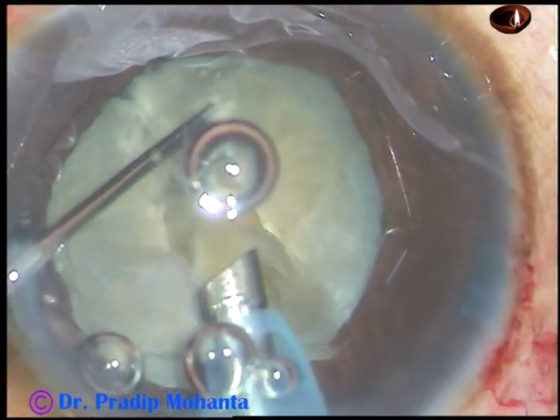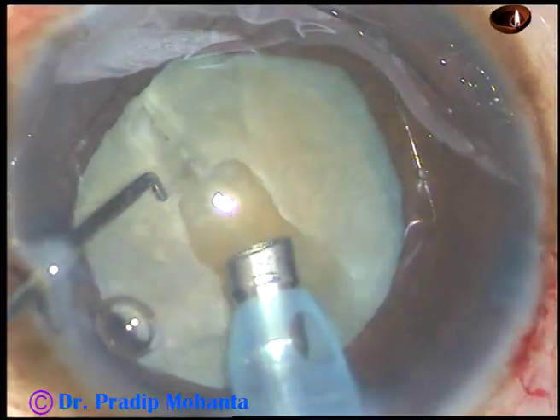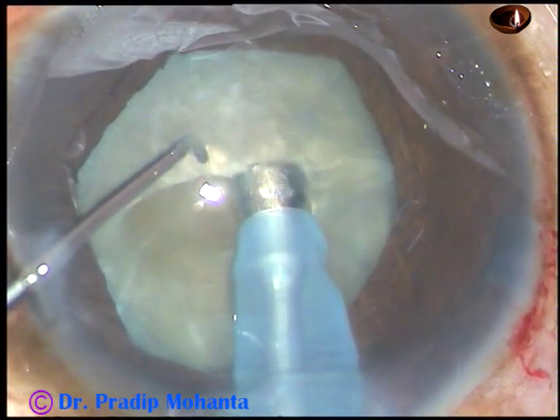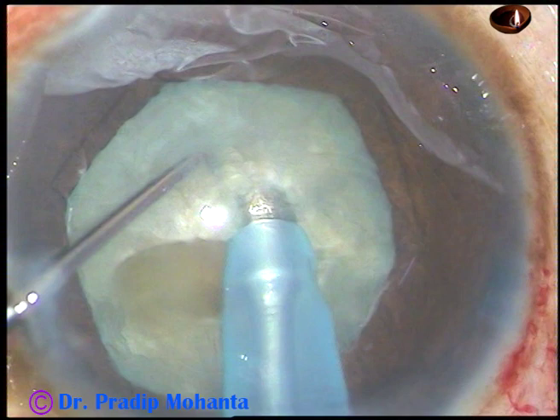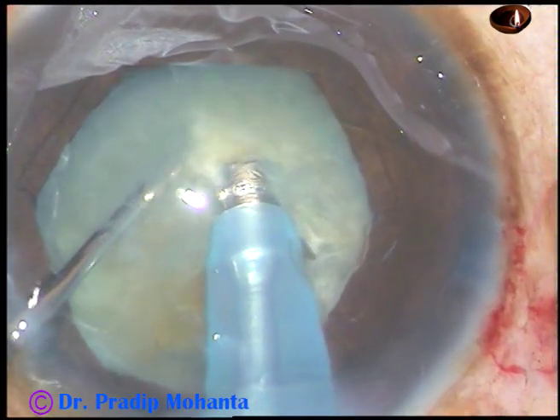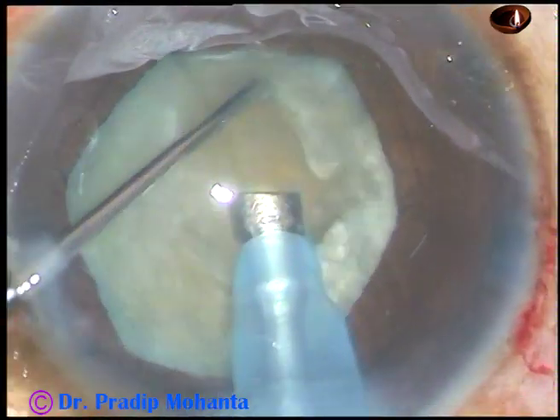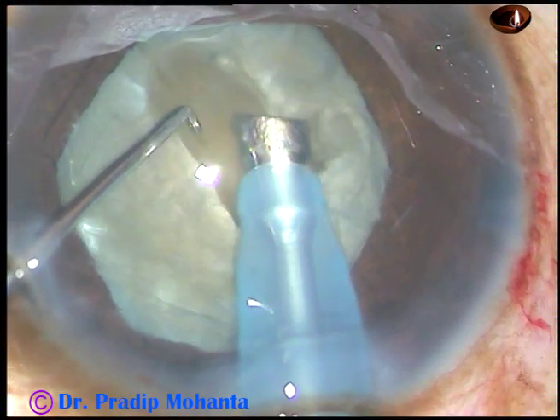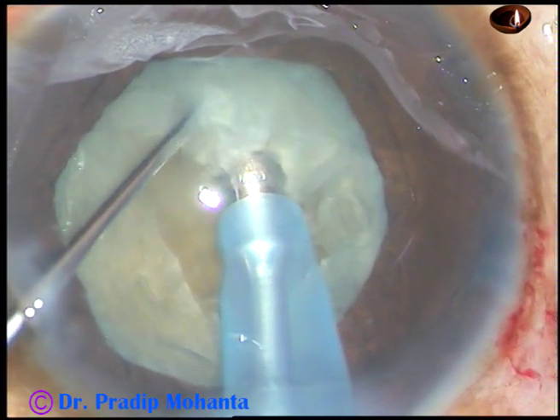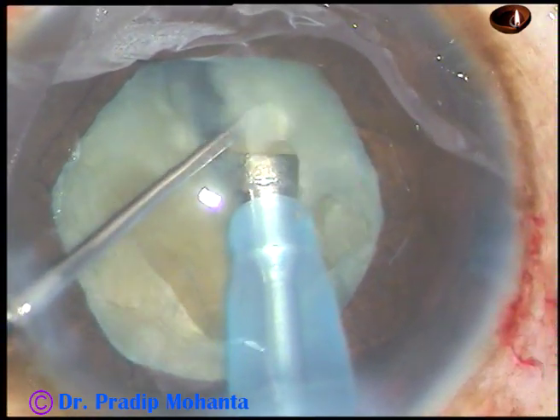This air bubble is causing some disturbance, so you just use vacuum and remove it. Now rotate. Hold the lens mass very nicely. Going into the substance of the nucleus again and chop it. Now see the chopper — how it is being placed. Don't just be in the superficial part of the nucleus; go really deep into the nucleus and then apply opposite forces to separate the pieces.